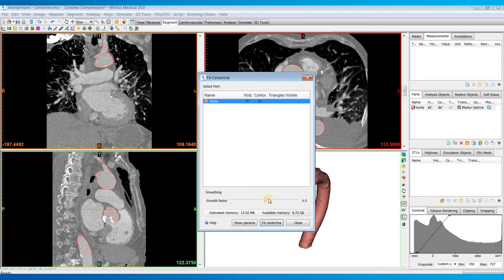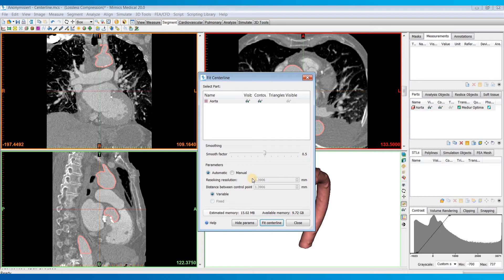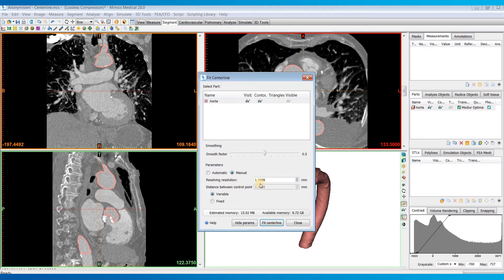In addition to the Smooth Factor, there are two advanced parameters, which you can adjust by hitting the Show Params button. So first is the resampling resolution, which indicates the size of the tubular structure that can be recognized by the algorithm. So a smaller resolution will include tubular structures with a smaller diameter and vice versa. By default, this parameter is automatically set to two times the pixel spacing of your images. And for most of the time, that works just fine. It can be left unchanged.